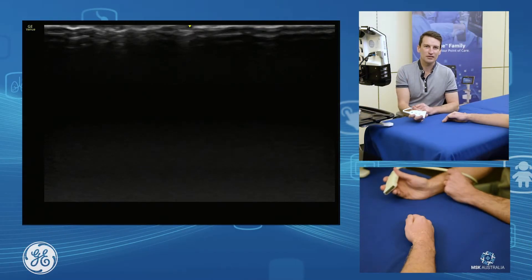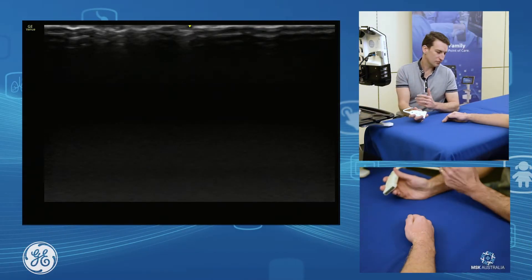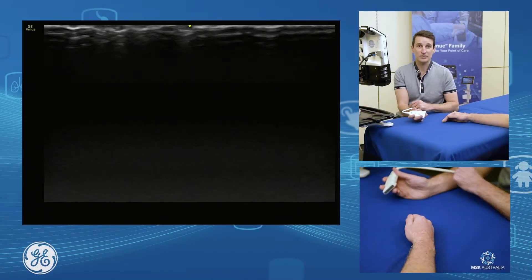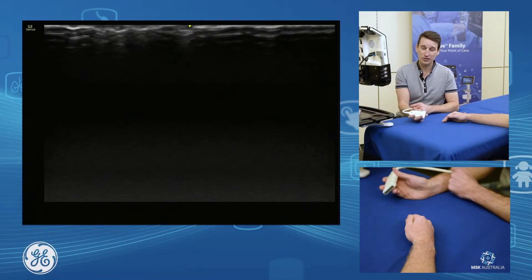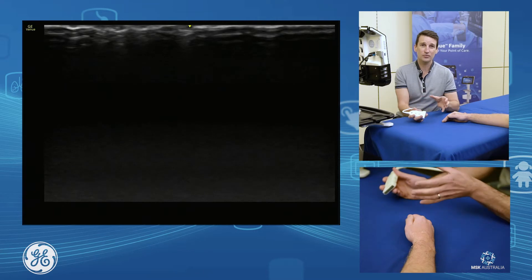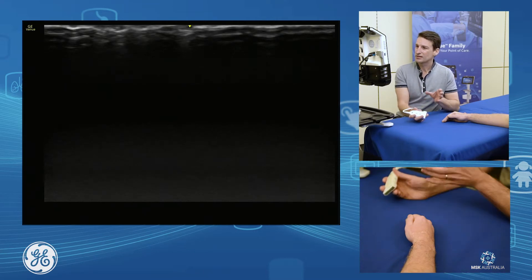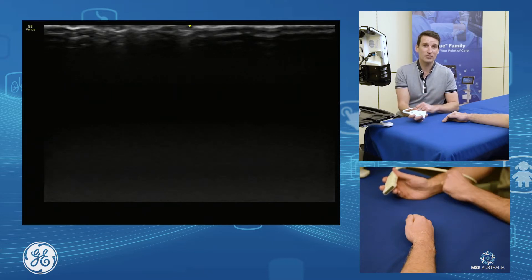We're going to talk about the dorsal aspect of our wrist joint. I'm going to run through the extensor tendon compartments of the dorsal wrist.